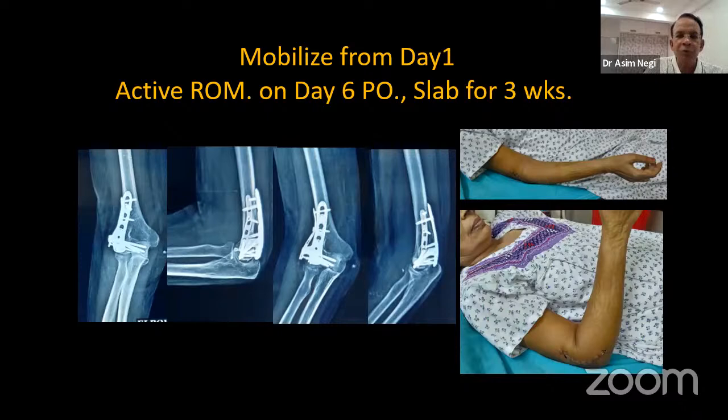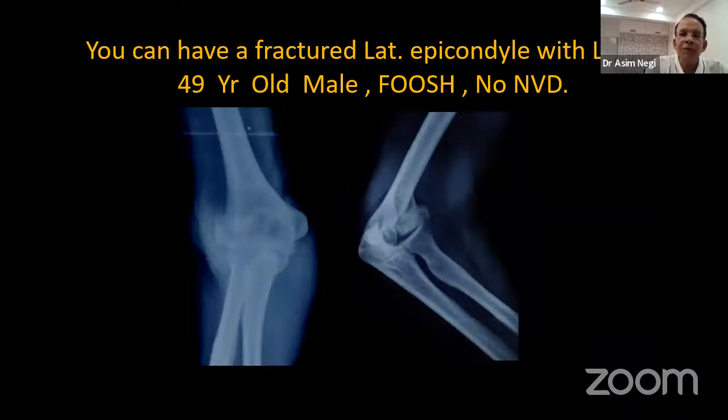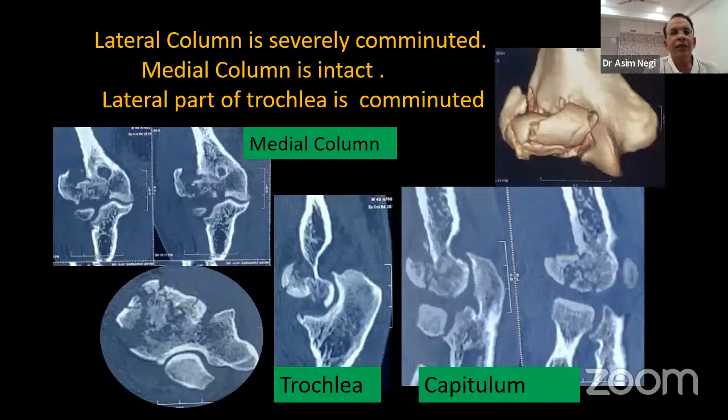Another patient, you can have a fractured lateral epicondyle with injury to the lateral collateral ligament complex. 49-year-old male, fall on an outstretched hand, no neurological deficit. This is his CT. Lateral column is severely comminuted. You can see that the lateral column is all gone. There are so many pieces there. Medial column is intact, as you can see here. Lateral part of the trochlea also is shattered.